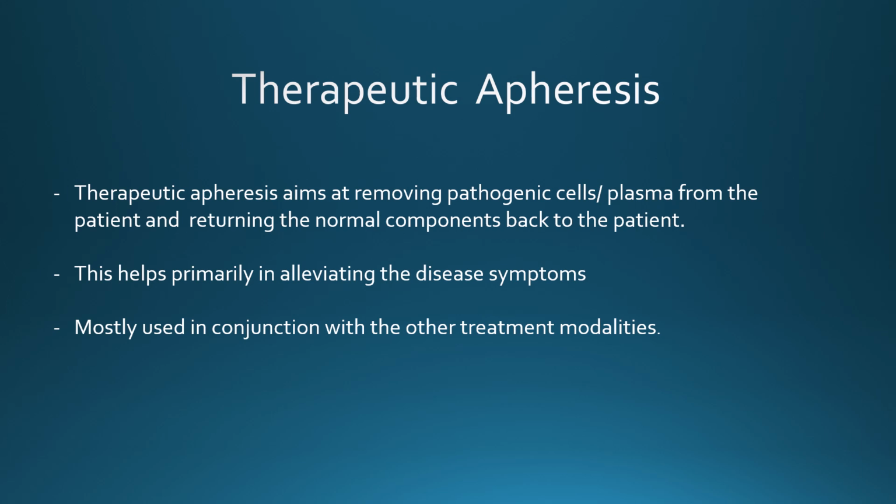Therapeutic apheresis aims at removing the pathogenic cells or plasma from the patient and returning the normal component back to the patient. So it helps primarily in alleviating the disease symptoms. Mostly it is used in conjunction with the other treatment modalities.